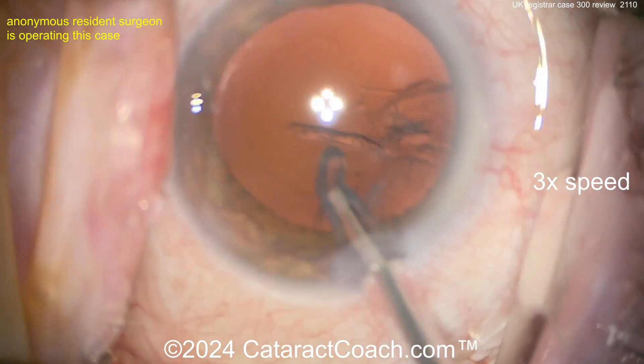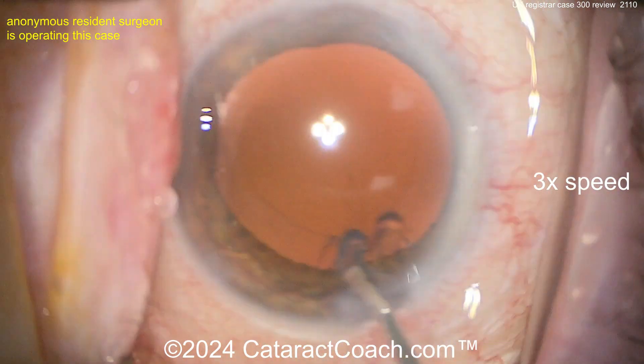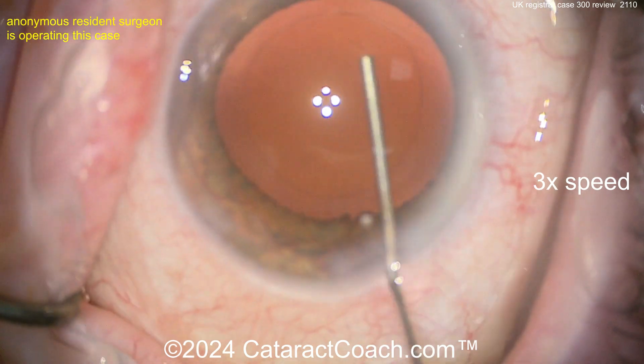The video looks fast, but if I showed it to you in real time — 12 or 13 minutes — you wouldn't watch it. You want to see it in four or five minutes. You can use the YouTube speed button to slow it down to half normal speed and watch it again at a slower pace.